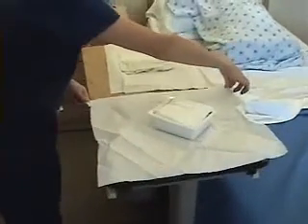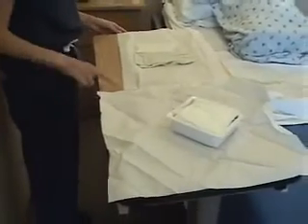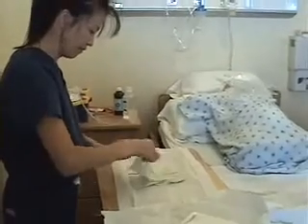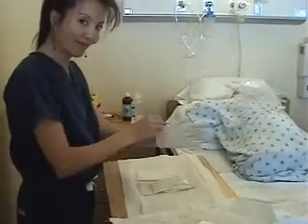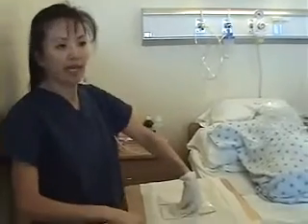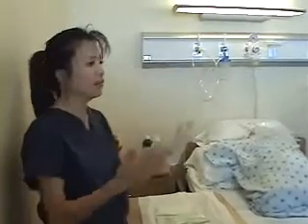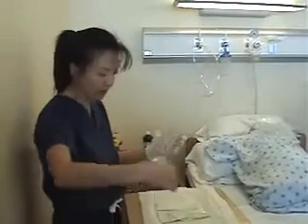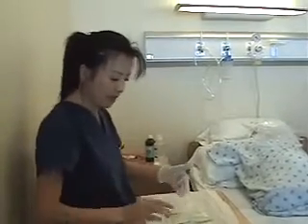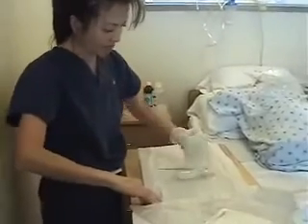Now I do want to manipulate the stuff inside here. This is sterile, so I am going to put on my sterile gloves first. This is about where I ripped mine. Remember, you can always use two hands. I think two hands are always a little bit easier than one hand. Even if you don't have to use this hand, that's a good idea, meaning that I don't want to touch this. But with your body, hold your body up. Two hands is always a little bit better.